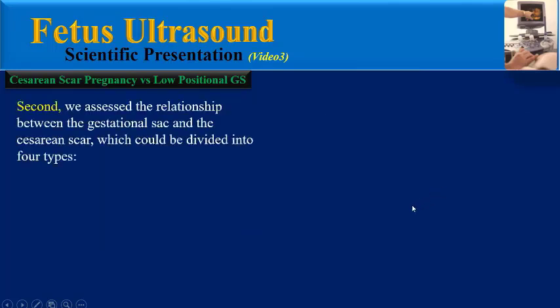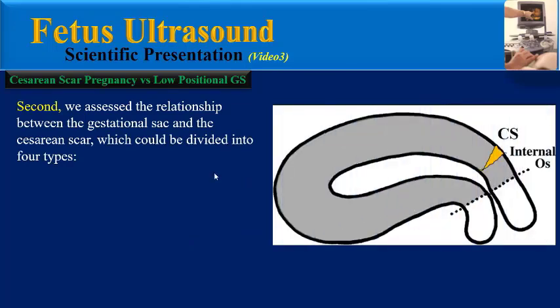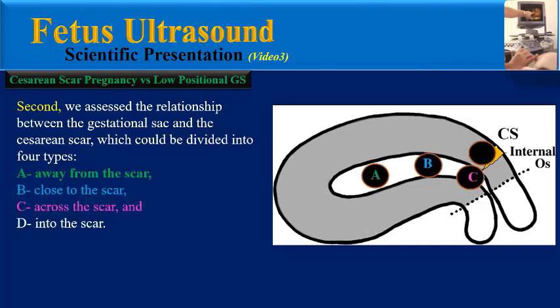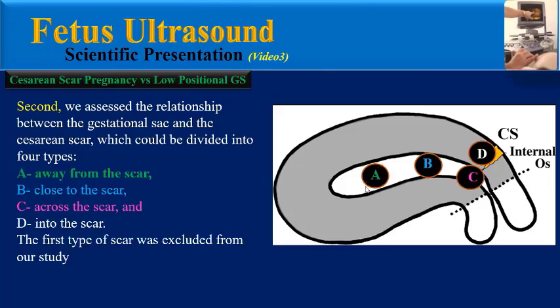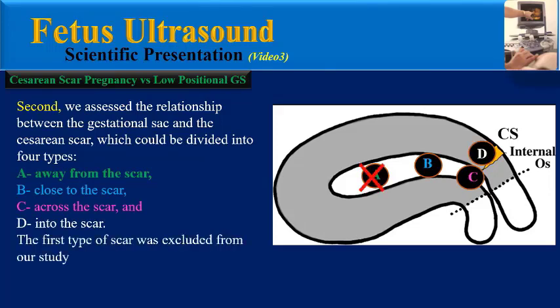In the second step, we assess the relationship between the gestational sac and the caesarean scar, which could be divided into four types: away from the scar, close to the scar, across the scar, and into the scar. Of course, in the first type — away from the scar — no further evaluation is needed.